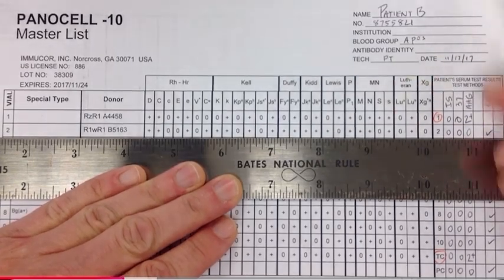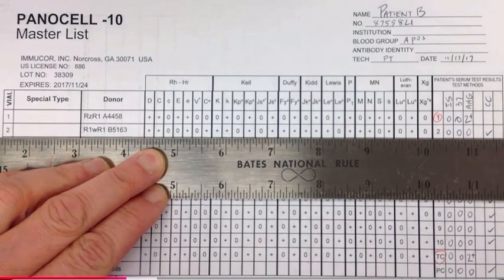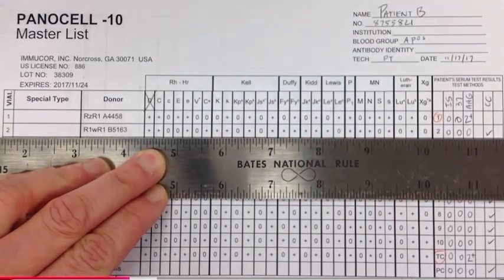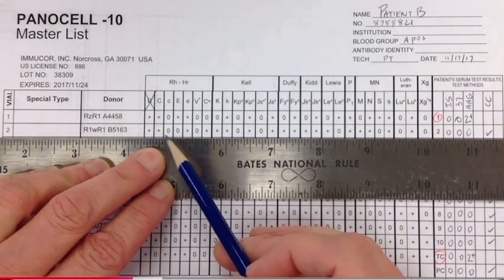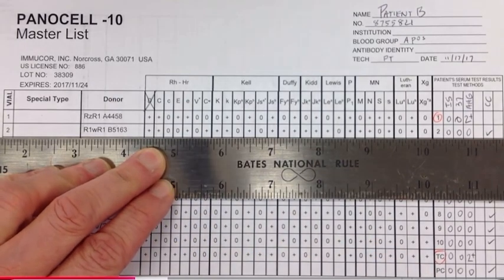So let's start here. Okay, so D, which is all by itself, I'm going to go ahead and completely rule that out by giving it a cross or an X. All right, now let's talk a little bit about dosage. So here we have big C and little c, and these are a pair. Therefore, we're going to take dosage into consideration.